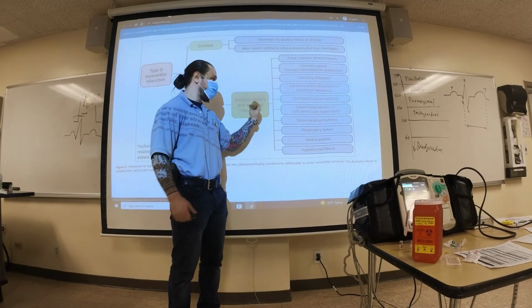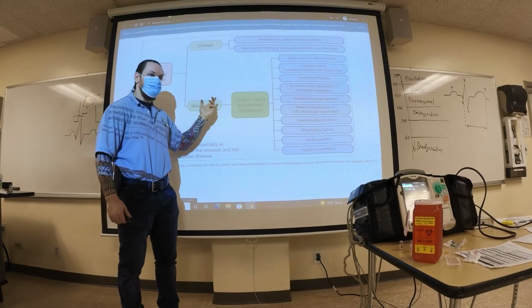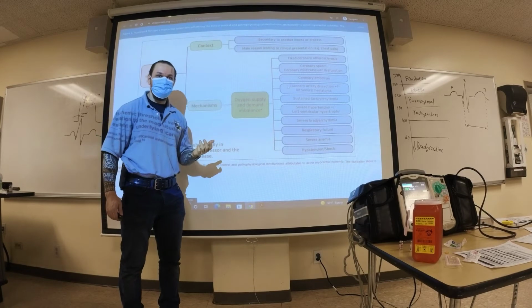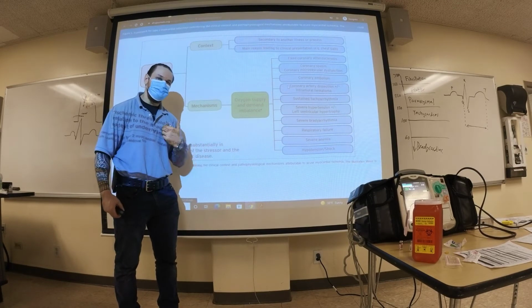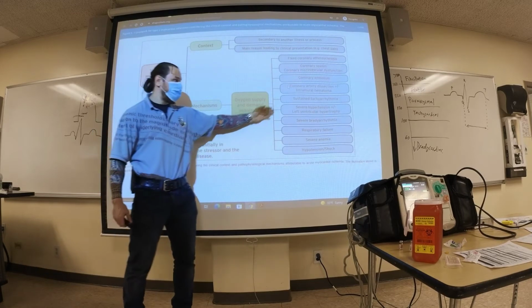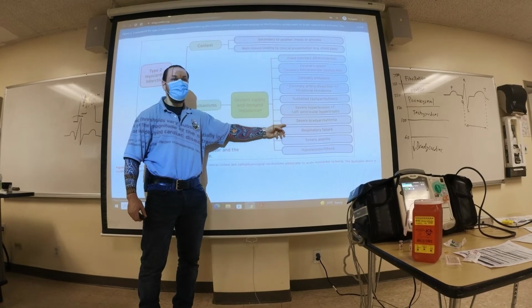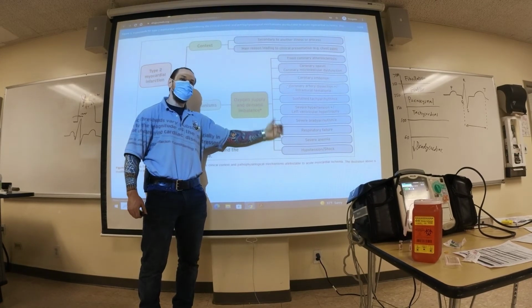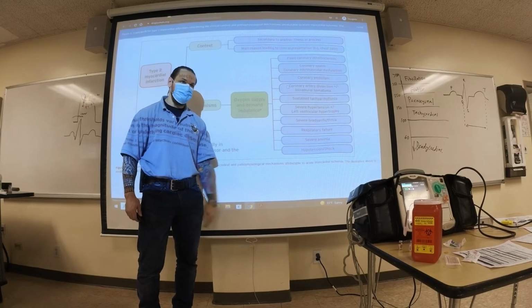In the field, do you know if it was from this or from a coronary thrombus? No. Who would know? The doctor. They've got to take him to the cath lab, come inside, put the dye in, see if there's a thrombus. But this is very, very likely: a sustained tachyarrhythmia or bradyarrhythmia can cause a heart attack. And you may see ST segment elevations. Up to 25% of these patients have ST segment changes. So do the 12 lead, please.